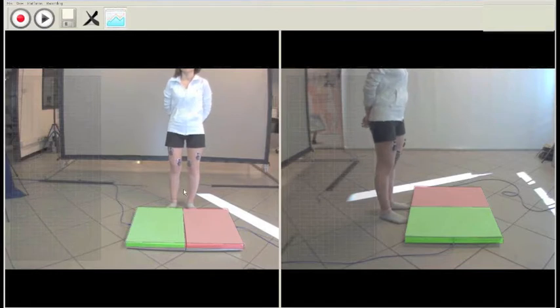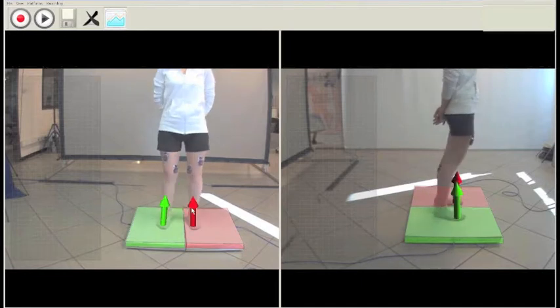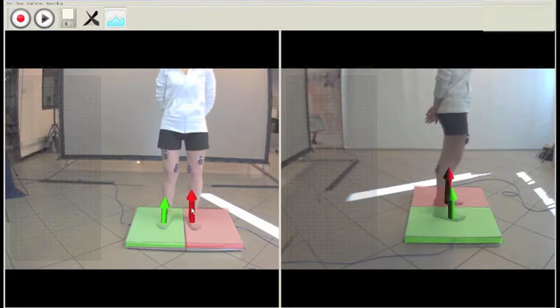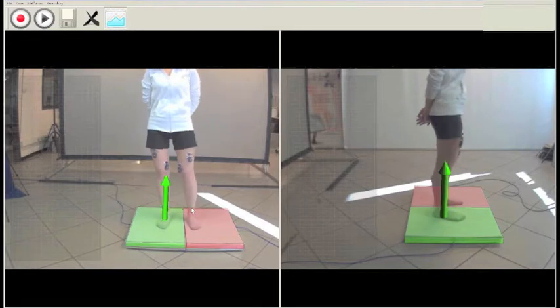She's already wearing the EMG, because in this way we are ready for the next acquisition. And I ask my subject to be over the platform. As you can see, the platform gives us back two vectors. Maybe you will lose a little bit of real time because it's quite a heavy video. There is a 3D reconstruction.